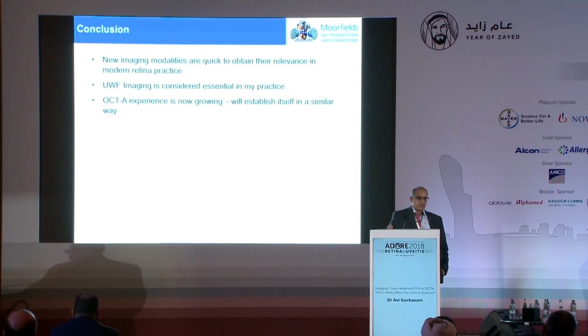So new imaging modalities, we are all very, very keen, and we're lucky that we live in this world of technology, that they very quickly establish themselves into the modern retina practice. I think ultra-wide field imaging, whichever system you use, is essential in my practice, and OCT angiography experience is growing, and is going to establish itself in a similar way as we learn more and more on how to use this modality.